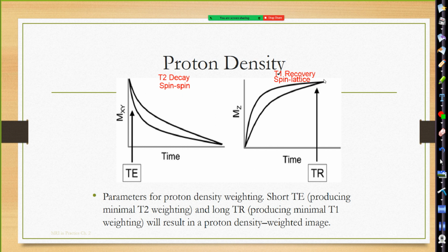No, and we're going to get to this in pulse sequences, but echo time is when we're collecting the echo, which is the signal that is coming off of the patient. So it's always associated with the transverse plane because remember, that's where our receiving coil is. So we'll get to it, but that's the time we're receiving the echo. And ultimately, what echo stands for is just that signal strength coming from that coil. From the patient, not to the patient. So don't get that confused with that transmit RF pulse that we're applying to the patient.